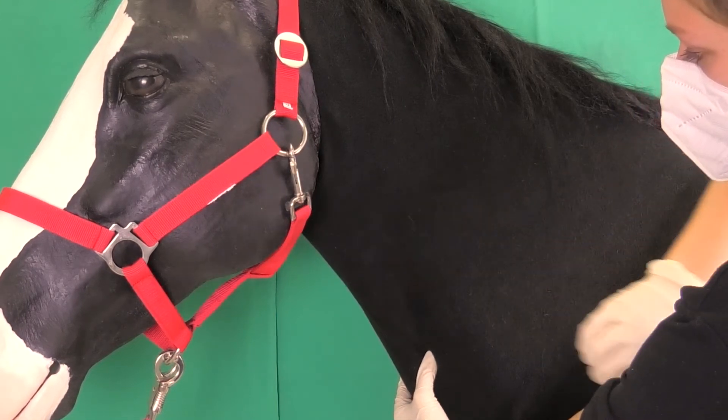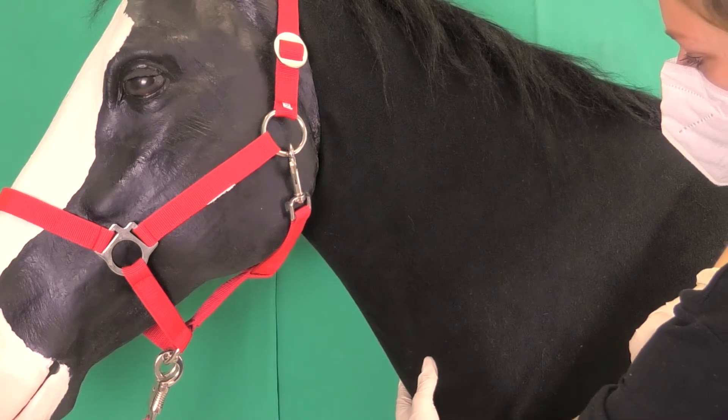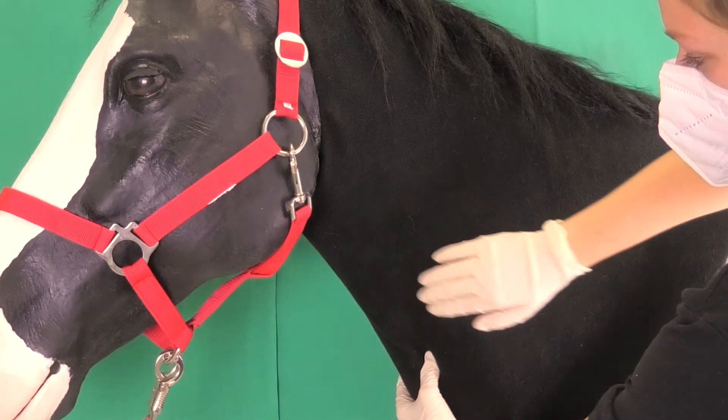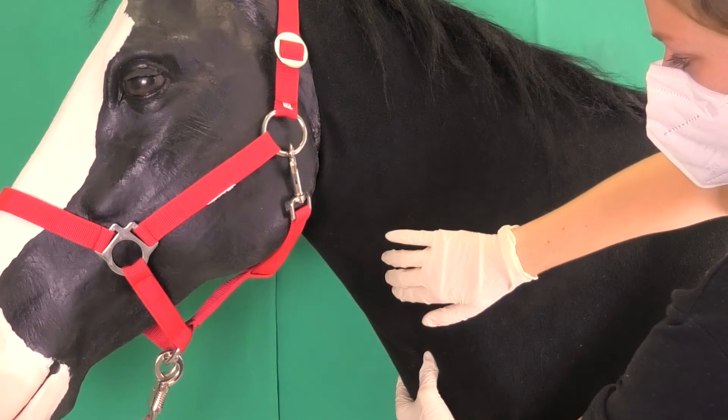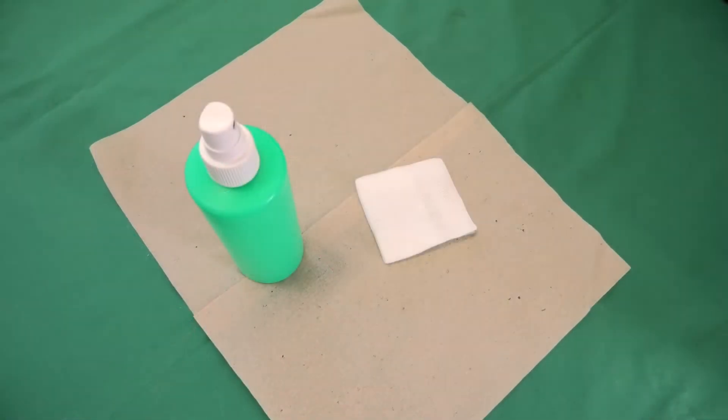The venous status test is used to check whether blood is accumulating and draining well in the vessel. The contralateral vein should also be checked. This step isn't carried out on the simulator. An obviously damaged vein should never be injected into.